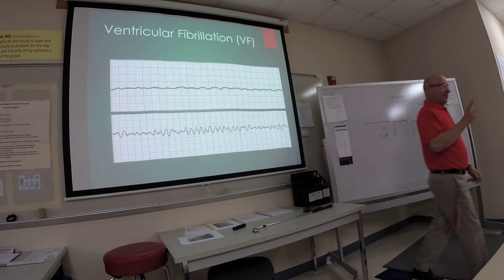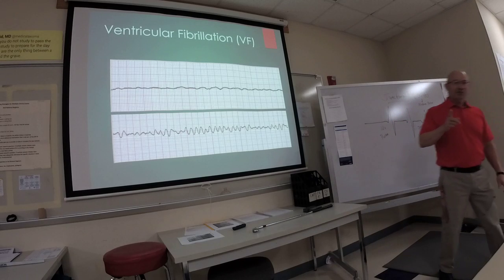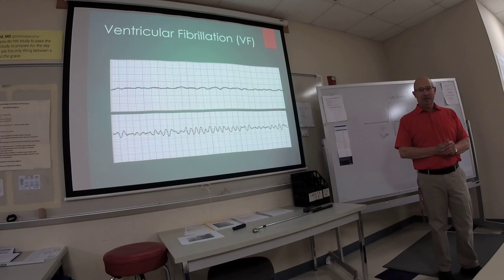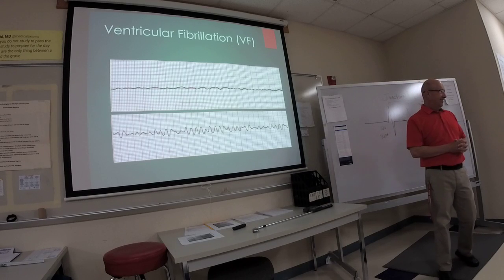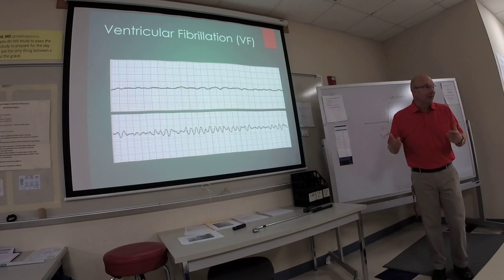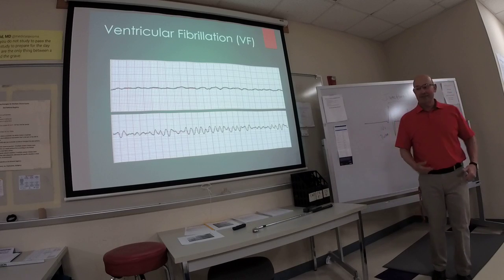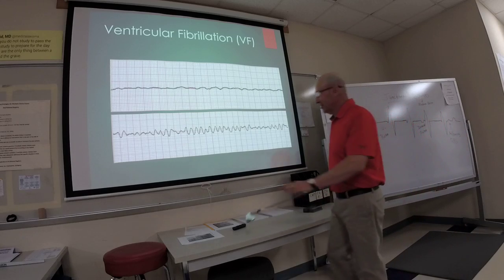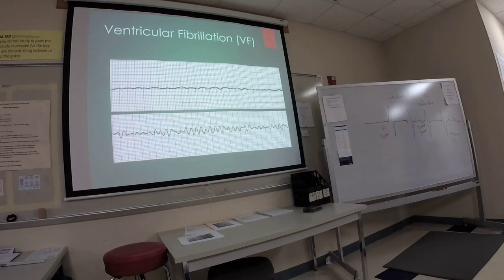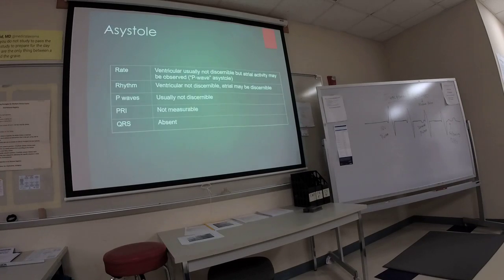Yeah, we could look at the monitor. So we go back to that common expression: treat the what? The patient. Always treat the patient. Your patient is looking at you, and you're scaring the daylights out of them. Maybe then they'll have VFib or VTach. You scared them into a lethal rhythm. All right.